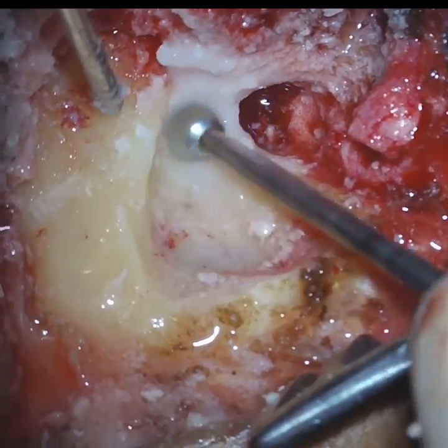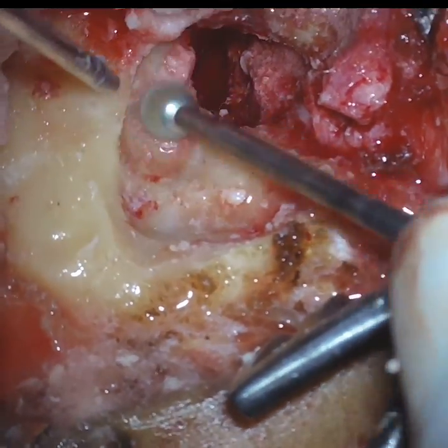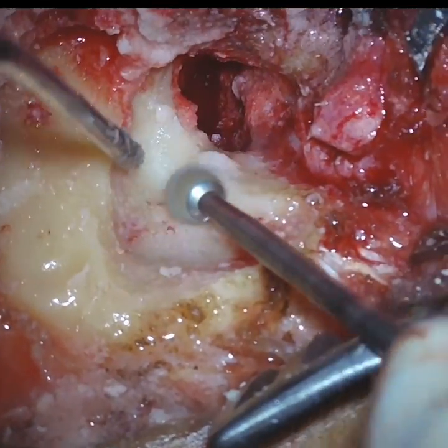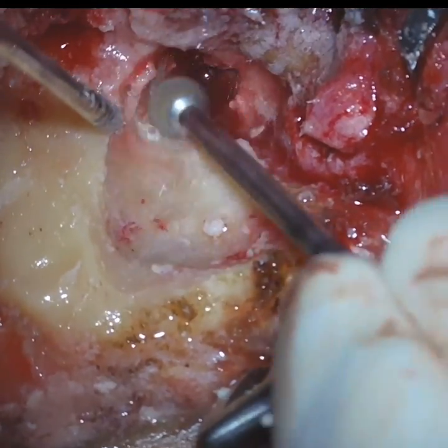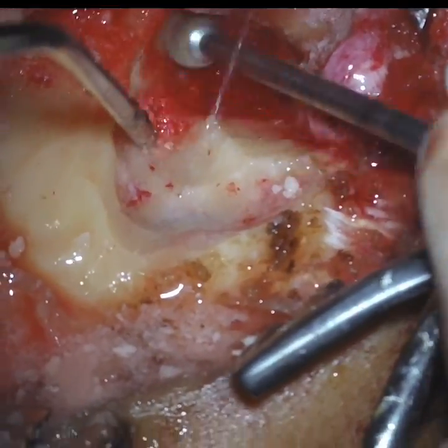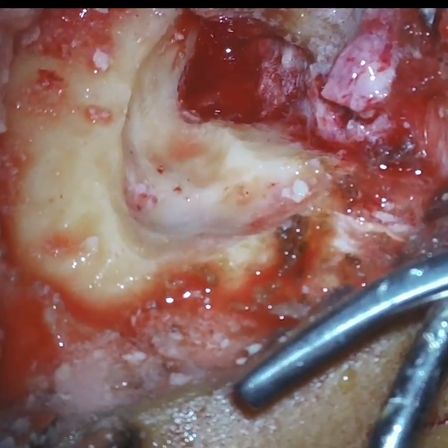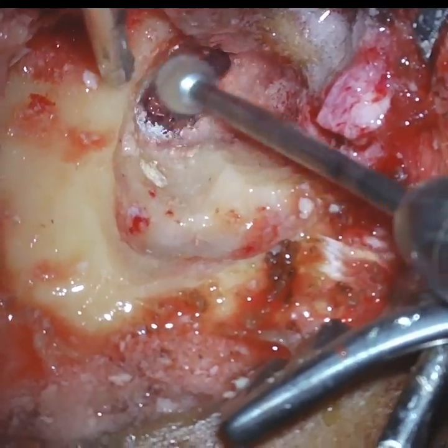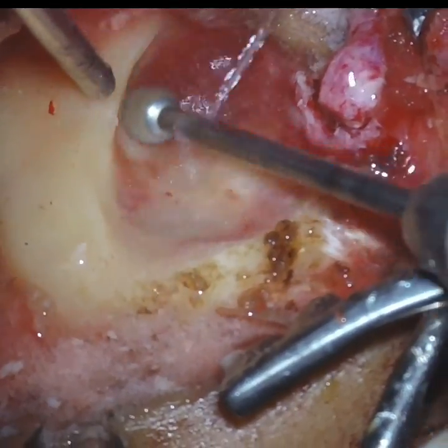and because there is already automastoidectomy here, the attic is fully destroyed. Now slowly we are going to drill the attic, and then we have to follow the cholesteatoma. Here we can see the cholesteatoma flakes, and now we have to slowly follow the cholesteatoma flakes where they are going. This is a big cholesteatoma, and it has completely destroyed the membranous labyrinth, bony labyrinth I mean.